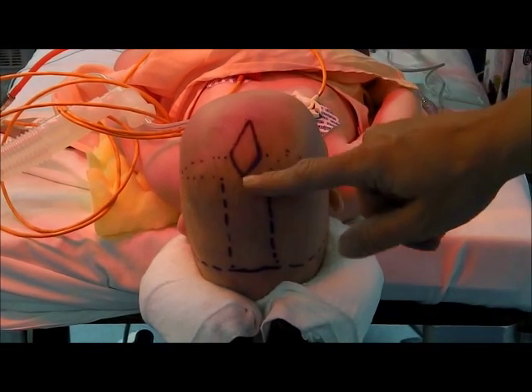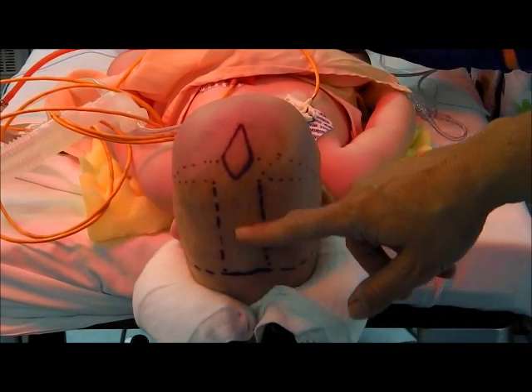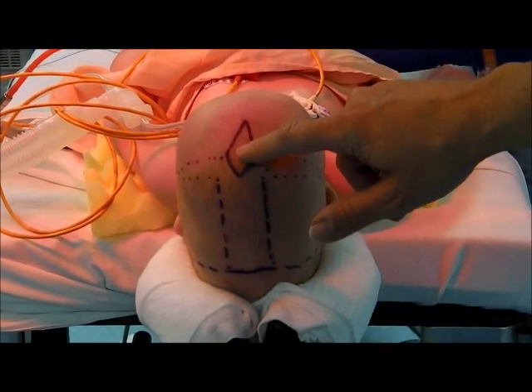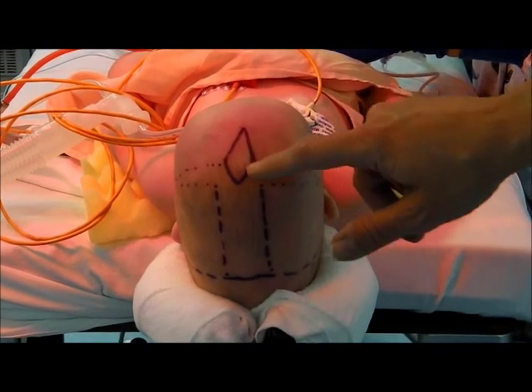This baby has sagittal synostosis. I know you can't see it, but I can feel the ridge that goes posteriorly, anteriorly to the baby's fontanel.